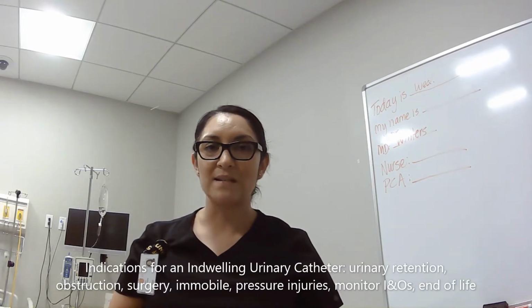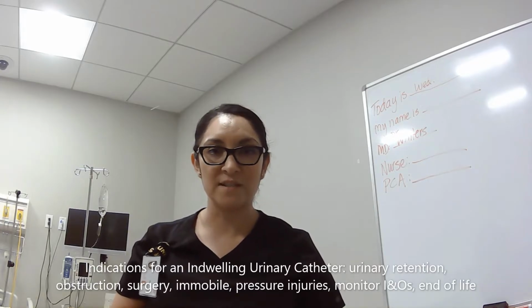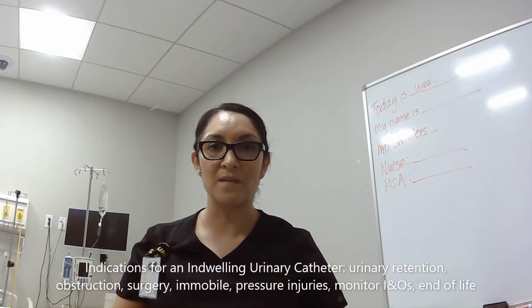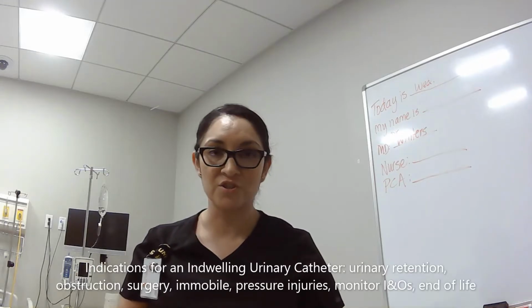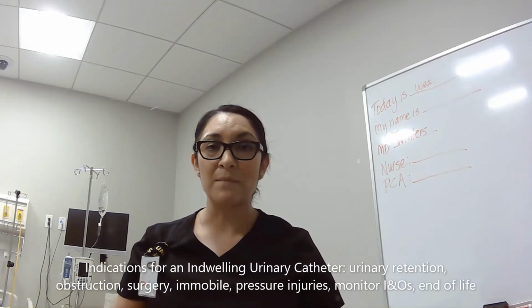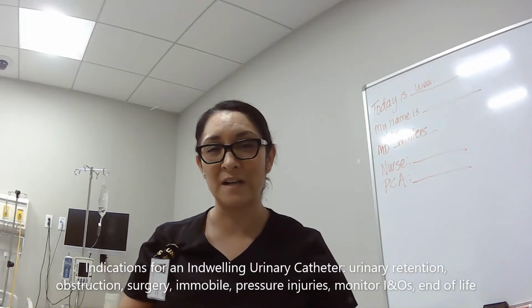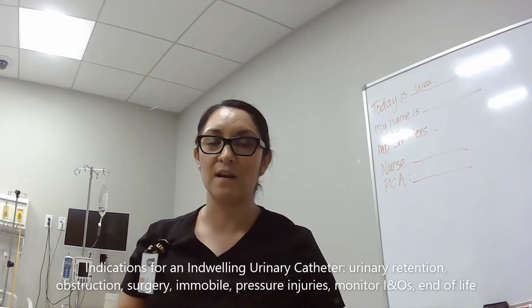It could be because they have urinary retention, obstruction, maybe they're getting surgery, maybe they are immobile, perhaps they have severe pressure injuries, maybe we need to monitor their intake and their output, so their urinary output. There are many reasons why the patient would need to have a Foley catheter inserted.